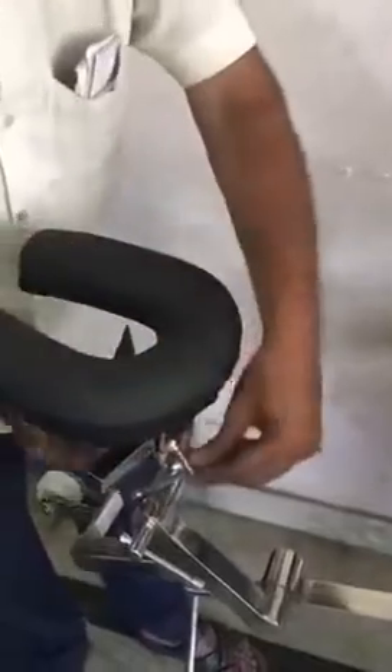Now moving with the final attachment which is called a head plate. This head plate has the base built in mild steel and with one inch mattress for the extreme comfort of the patient. We are done with this part and fortunately this section can be attached on the left section and onto the head section both.